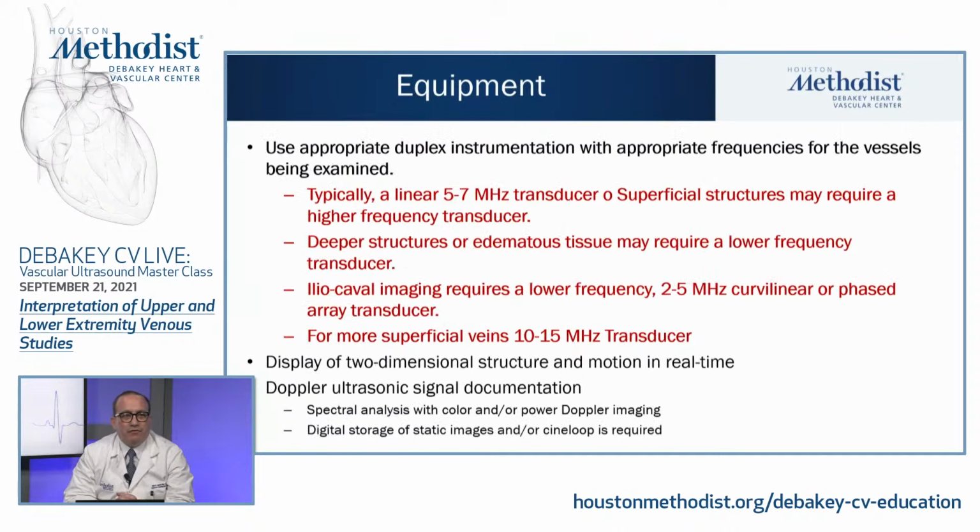Again, we use a 5 to 7 megahertz transducer. For the deeper structures, you need to decrease the frequency to anywhere between 2 and 5. And for more superficial veins, you may want to increase the frequency to 10 to 15 megahertz.